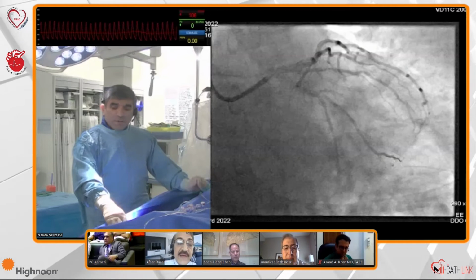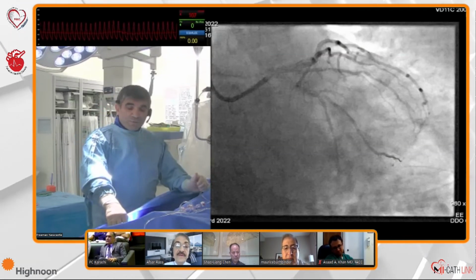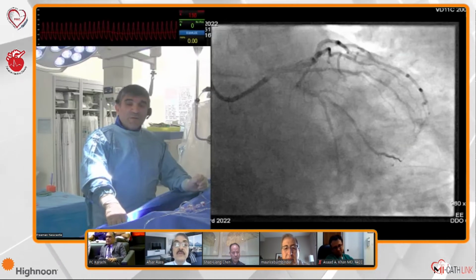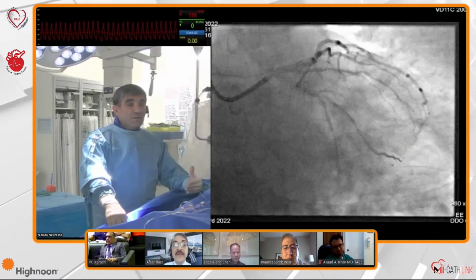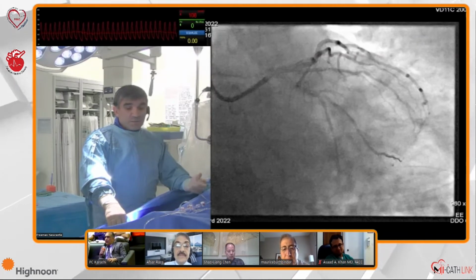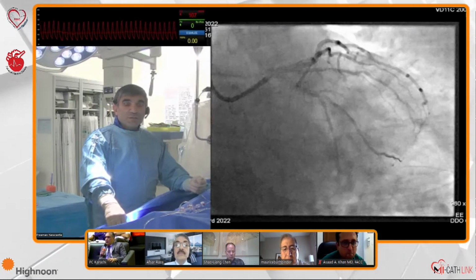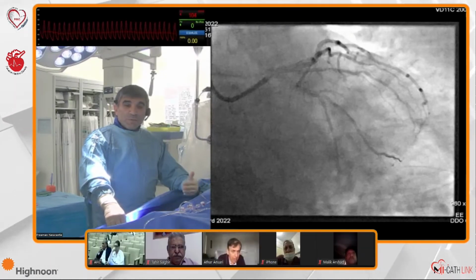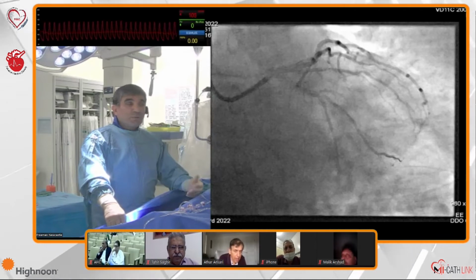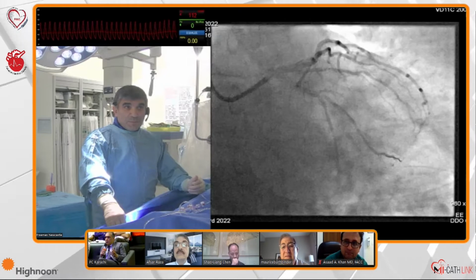Yes, okay, good. As I said, a 66-year-old gentleman with hypertension, dyslipidemia, and a positive family history of ischemic heart disease with angina, who underwent an angiogram showing ostial circumflex and distal left main disease. He was discussed at the JCC with the surgeon, and the decision could go either way, surgery or PCI, and we opted for PCI. And this is the case.